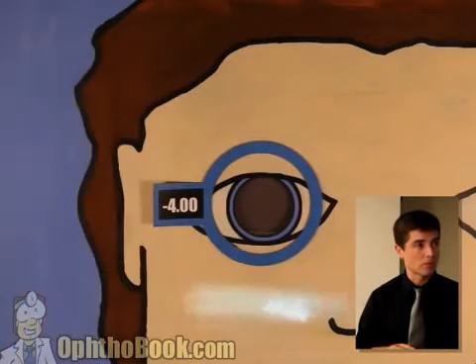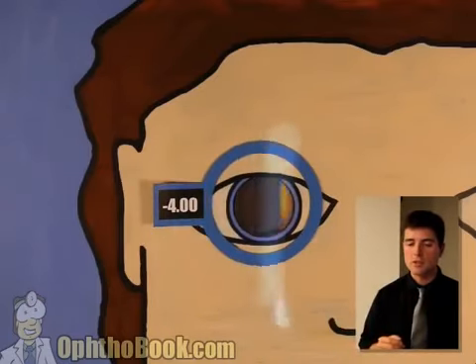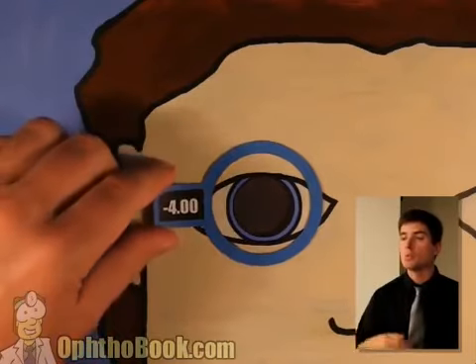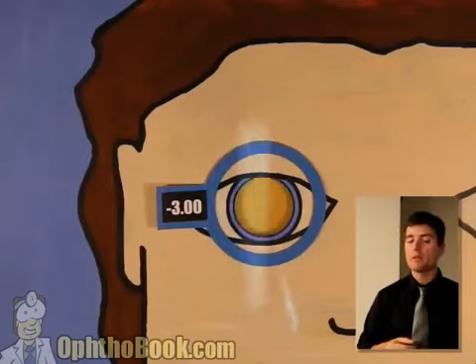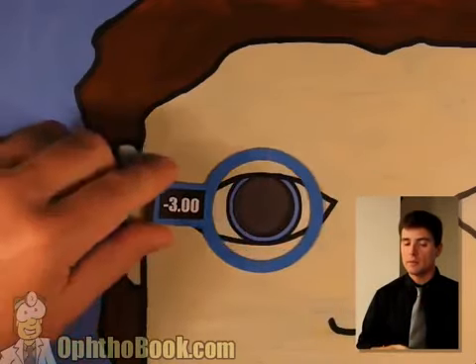So let's throw a -4. All right, we definitely have with this, so this is good. Let's try the other axis, make sure it's still good. Now we have with in all meridians. We can continue with step 2, which is where we add power to neutralize the reflex. Try -3. I think we've got it. We've got it this direction. So let's set this lens aside before we get confused.